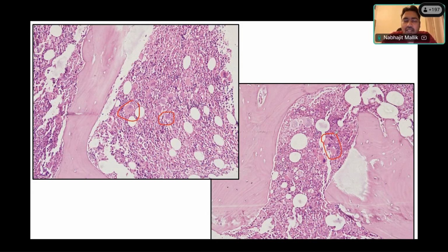Bigrai, where should megakaryocytes normally be lying in the bone marrow? What is the area? In the center, in between the intertrabecular space. Absolutely. So in the interstitium, next to the sinusoids. That is where they should be. And why should they be next to the sinusoids? What are they doing? They're producing platelets, and these platelets are directly released into the circulation via the sinusoids. That is why their location should be in the perisinusoidal region.